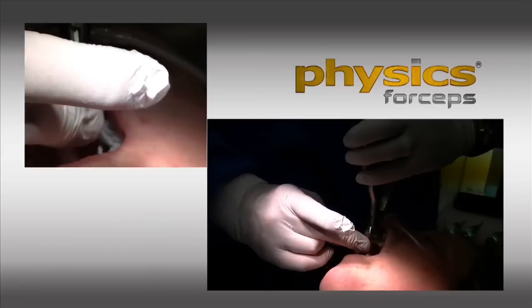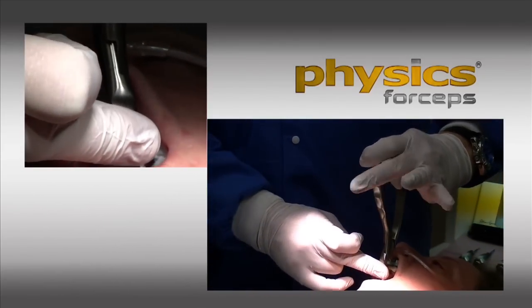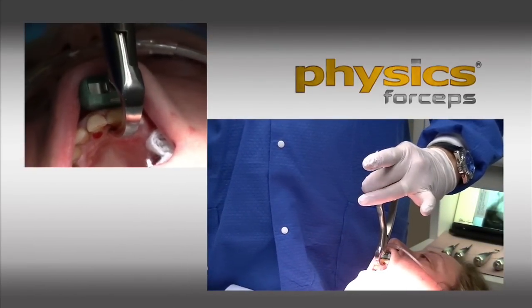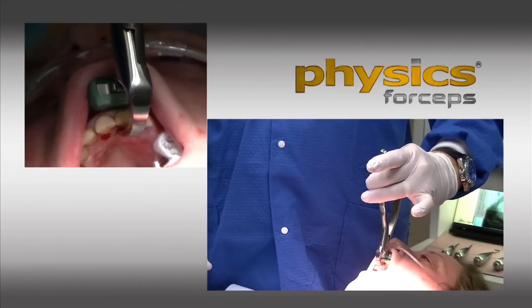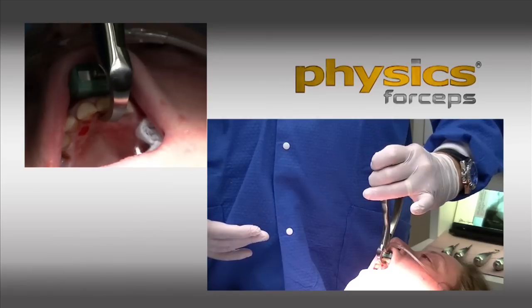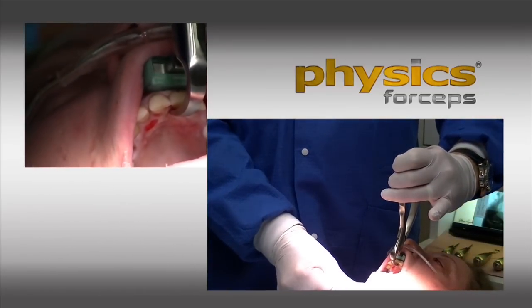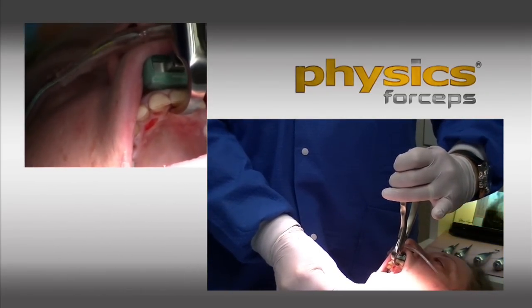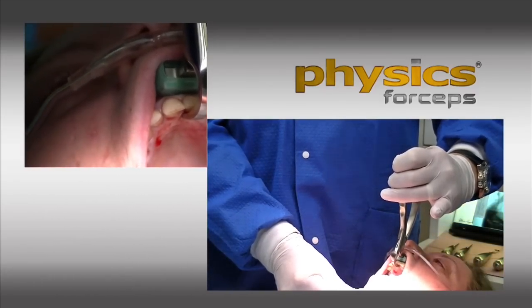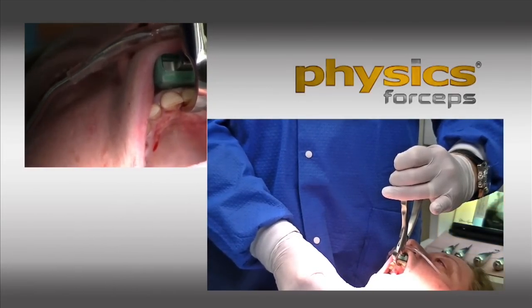for any inconsistencies. So what I have is the beak engaged onto the palatal surface and the bumper as high up the vestibule as possible. Then I'm simply using really just two fingers, or a finger and a thumb, and I'm rotating my wrist. There's no forearm pressure, there's no bicep pressure. I'm just rotating my wrist slowly, rotating my wrist towards me. Not moving my arm, not squeezing like a typical forceps, but simply rotating my wrist. And it may take a minute or two, which is a long time for us general dentists.